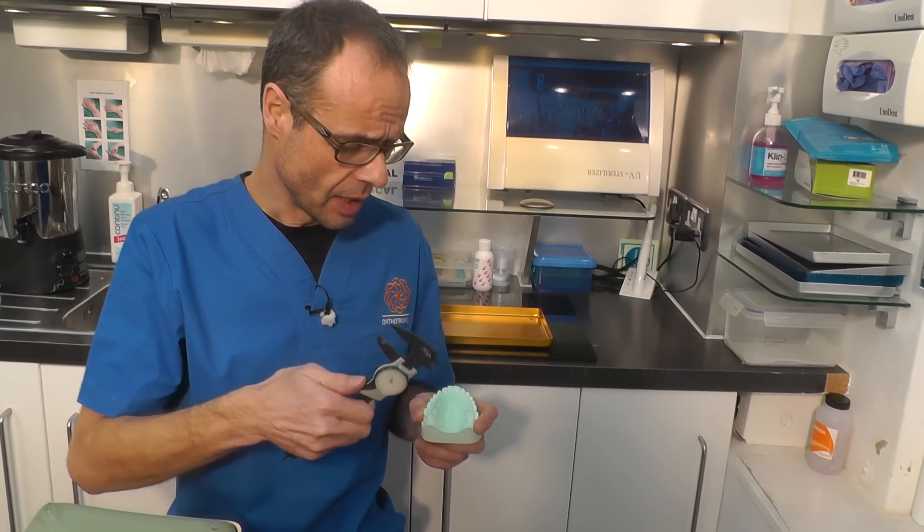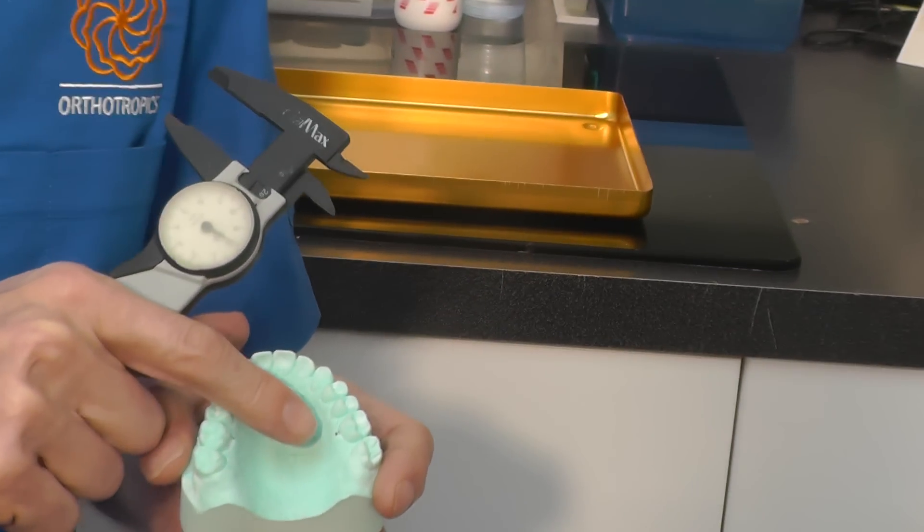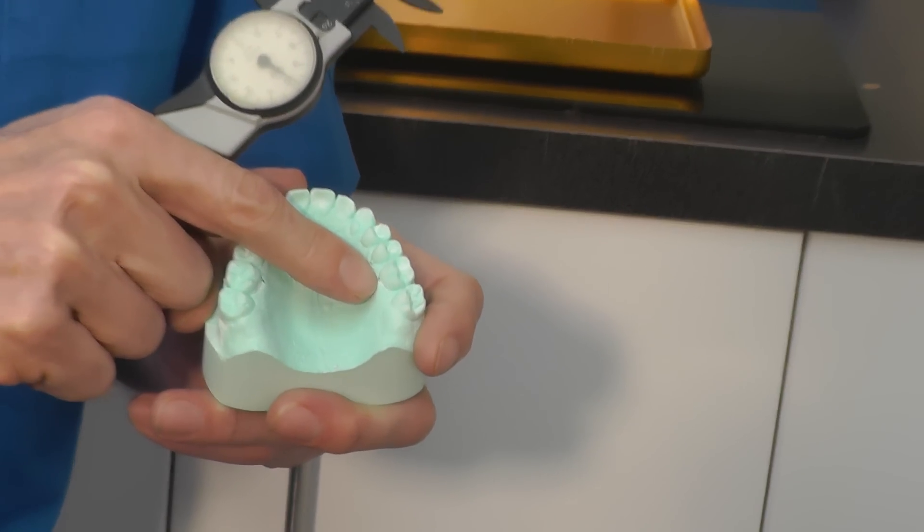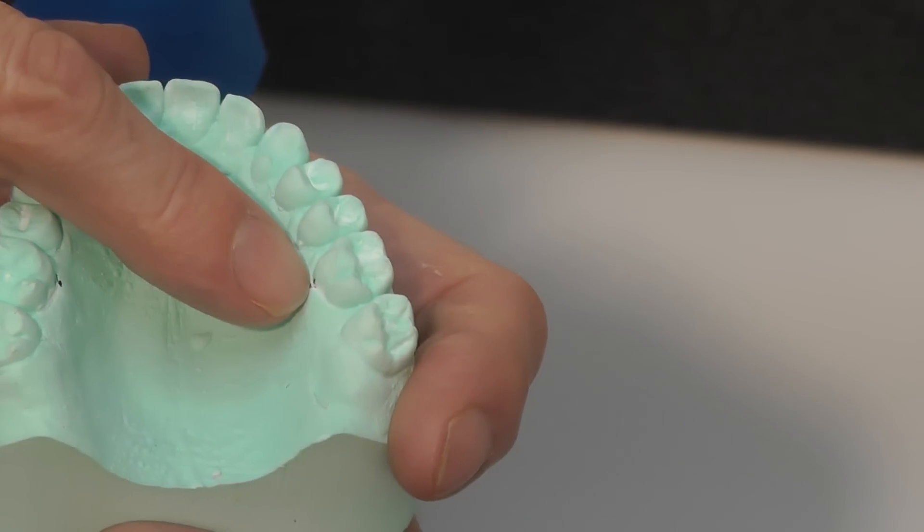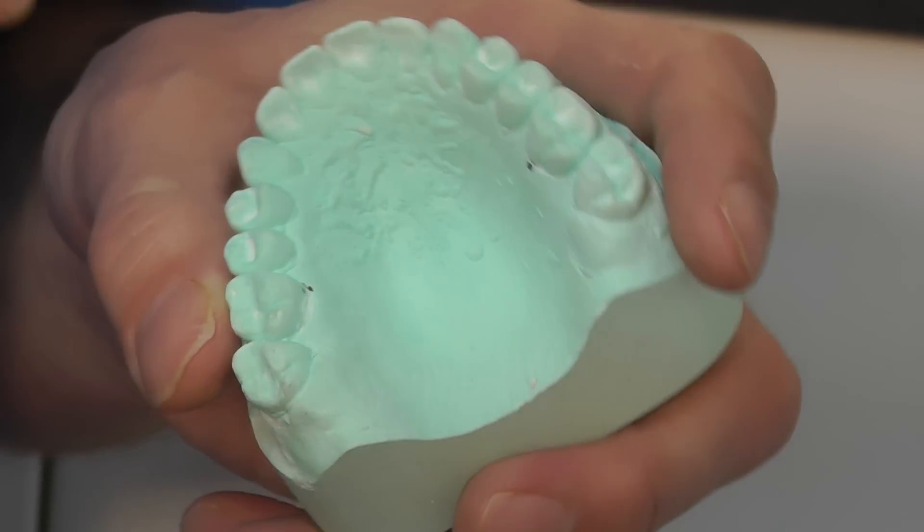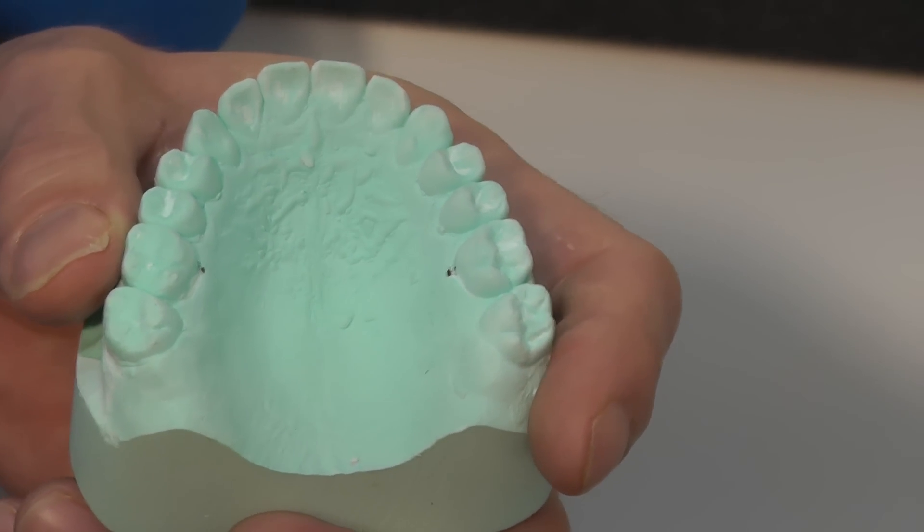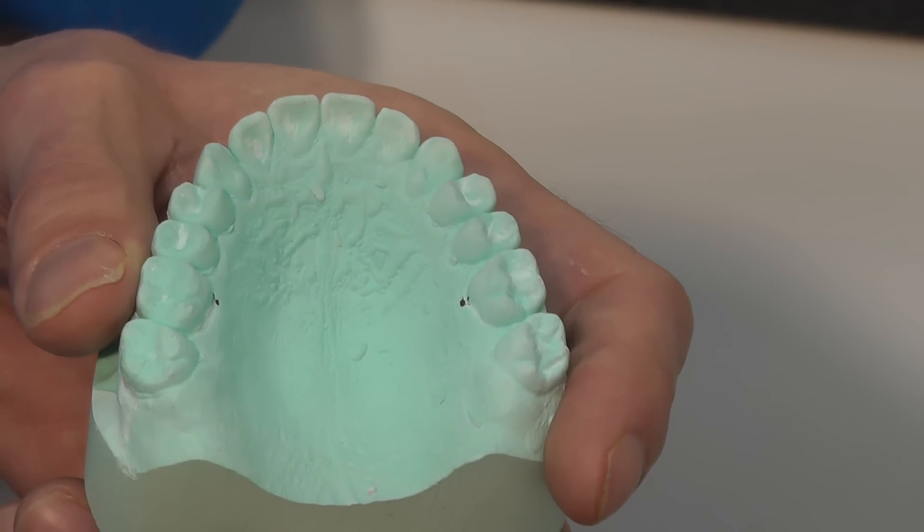We measure this using a dial caliper available from most hardware stores, measuring from the most gingival point of the molar on one side to the most gingival point on the other side. Those are the points marked closest to the gum. This seems to be the most reproducible point.